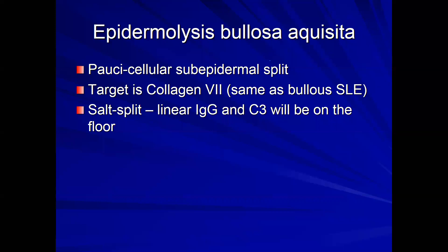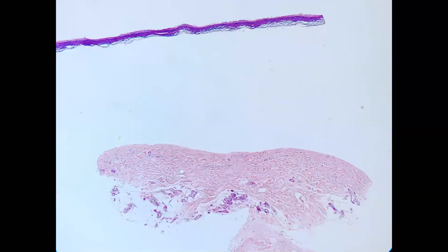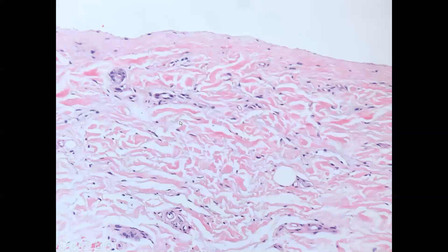Moving on to epidermolysis bullosa acquisita — a paucicellular subepidermal split where the target is collagen VII and linear staining on DIF will be present on the floor of the blister. Here's a picture of the epidermis floating off from the dermis in a patient with EBA. From low power, there is very little inflammation. On closer view, this is a clean split — an autoimmune blistering disorder — with very little inflammation.